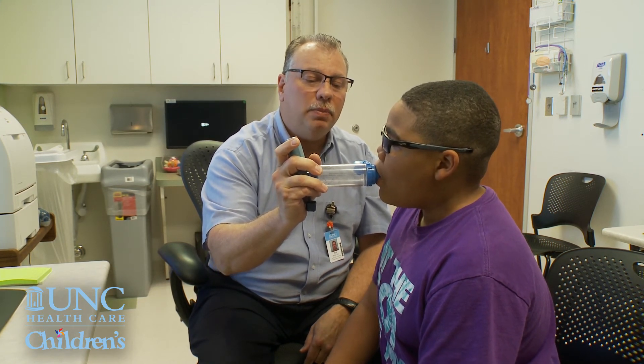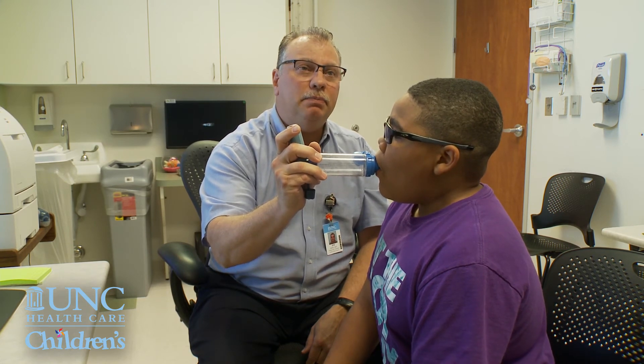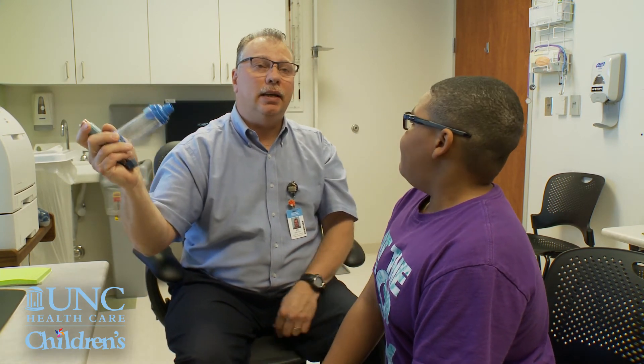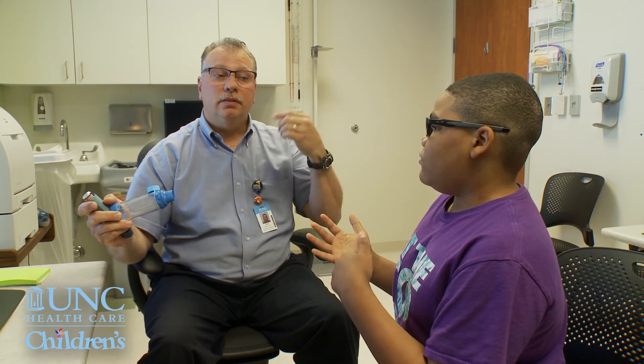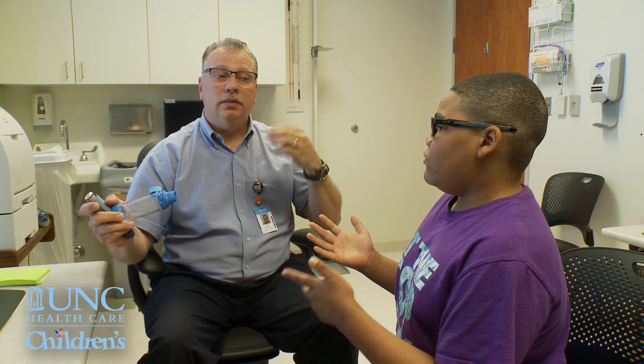Big breath in slow — big, big, big. Hold your breath, let's do a 10 count. 4, 5, 6, 7, 8, 9, 10. Let it out easy. And you're supposed to wait one minute in between each puff. One minute.